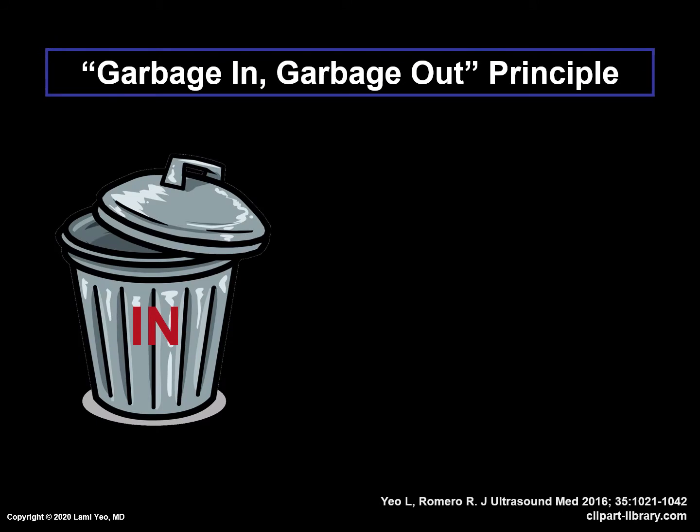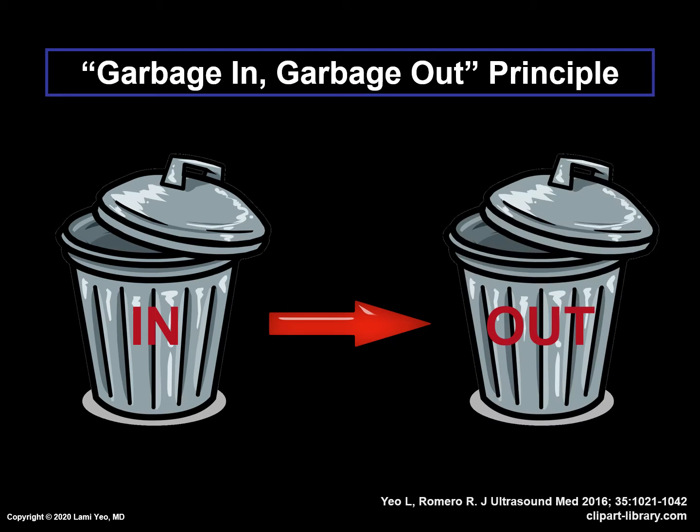In essence, the garbage in, garbage out principle used in computer science also applies to STIC volume datasets being analyzed by FINE. If there is an issue with the original volume, then this will affect the success of the FINE method, and FINE itself cannot be blamed.